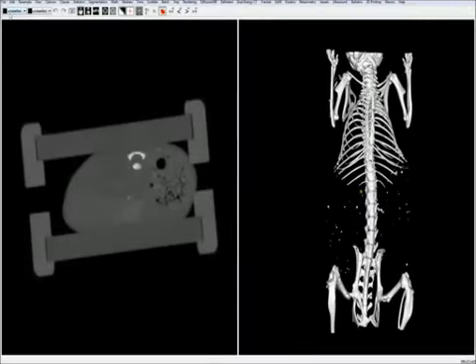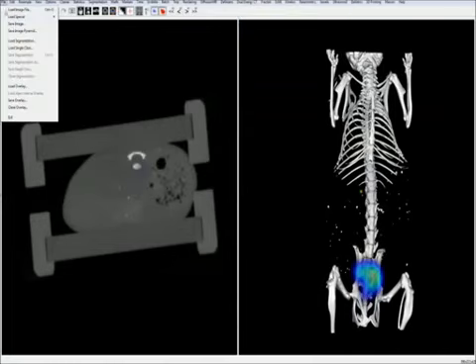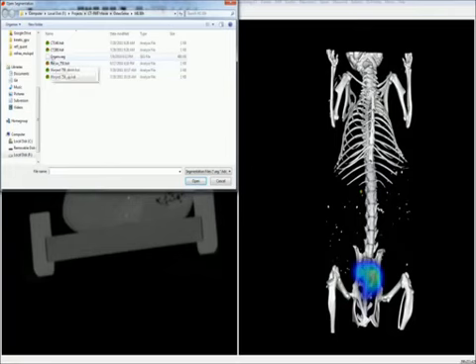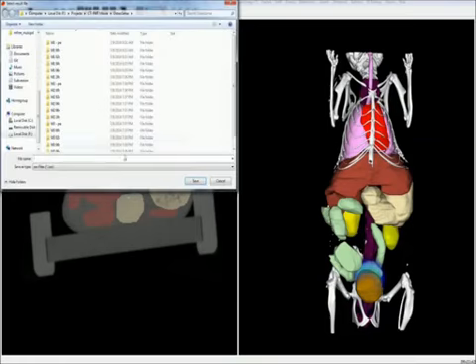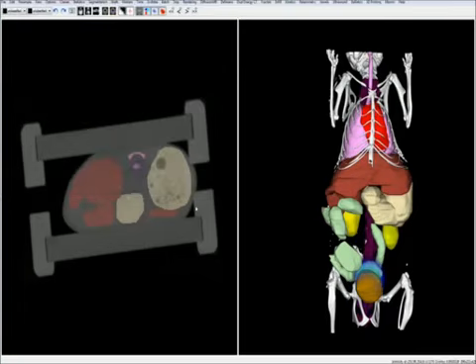To quantify the results, load an overlay and a segmentation. Click Set Batch Settings to let the program remember the current settings. Now click Batch Statistics to tell the program to compute the values for all regions in all µCT-FMT scans. This will take a few seconds. Then the statistics are saved in one spreadsheet file. This is convenient because the user does not have to merge dozens of files himself. Based on this file, the organ curves can be computed.